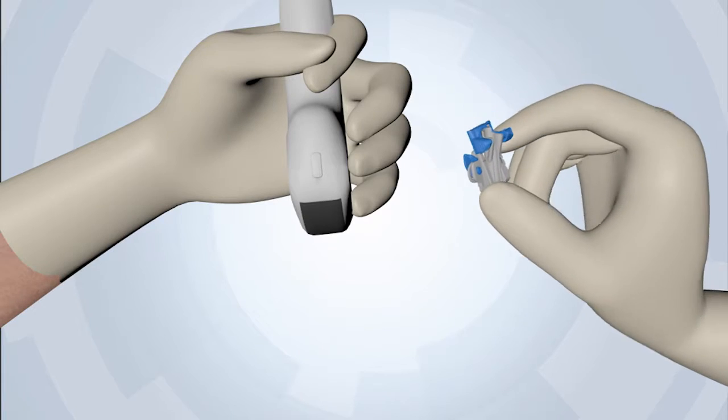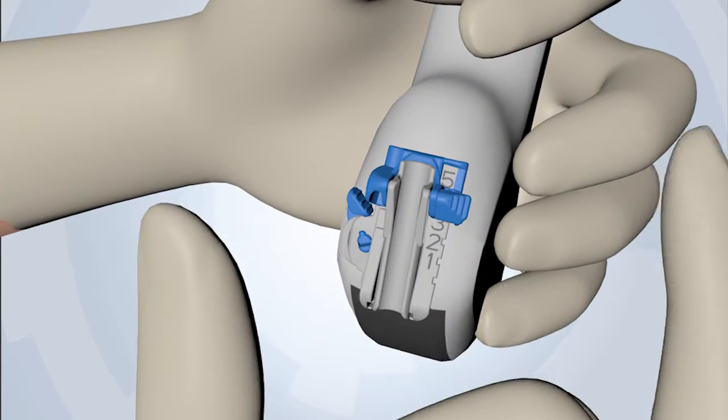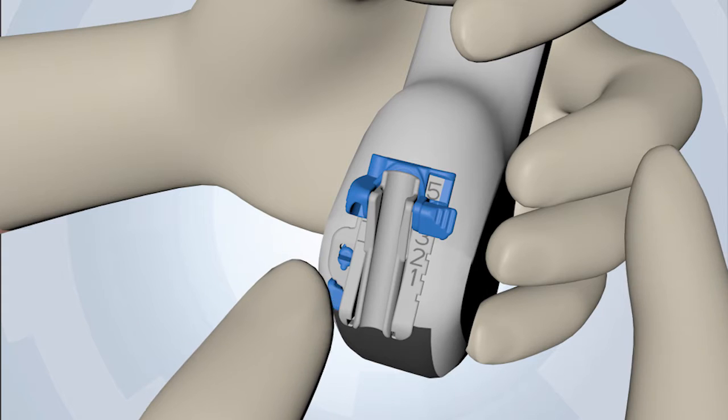Versa is aligned and placed over the VersaLink locating feature on the transducer. The guide is then locked into place.